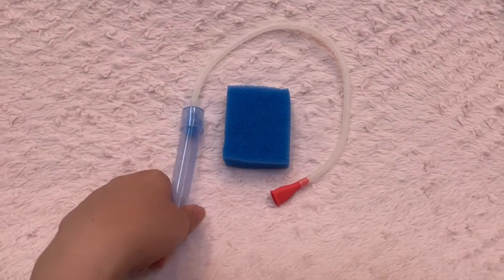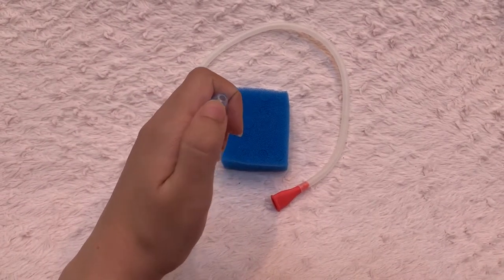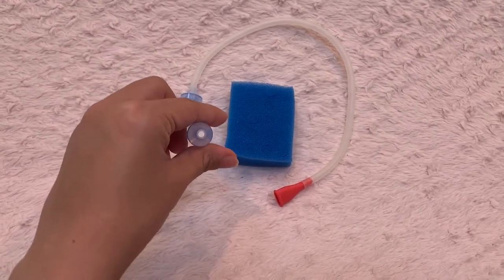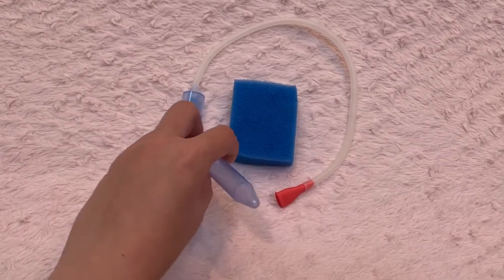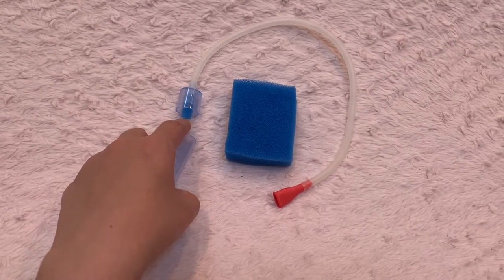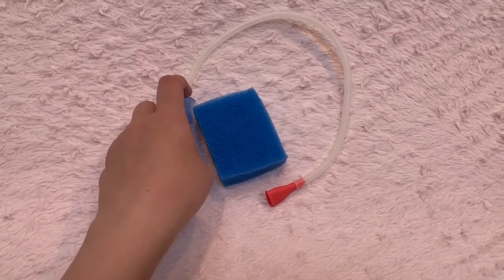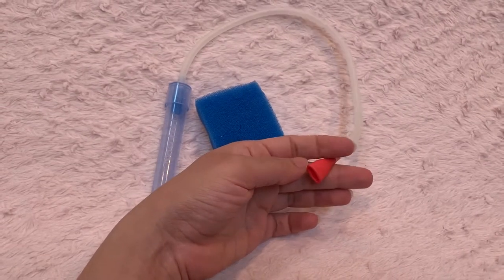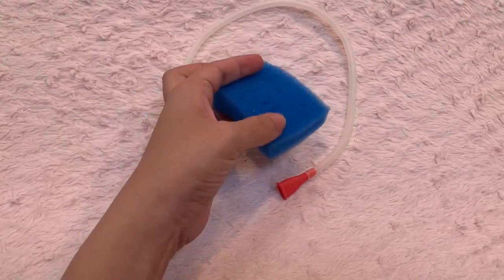It's made of a tube with a hole at the end. This part goes inside the baby's nose, and you want to put it in as tightly as possible so there are no air gaps around it, so you can efficiently suck out the snot. It also has a filter that will prevent any snot from going inside the tube and into your mouth, and this red part goes in your mouth for you to suck out the snot.